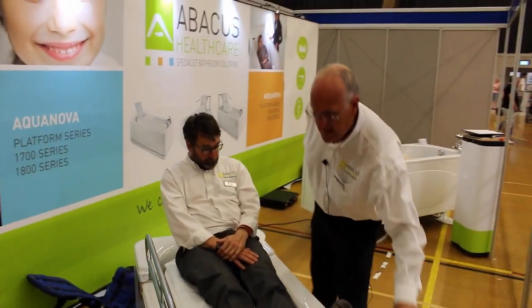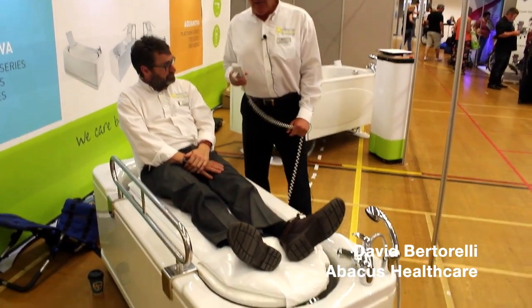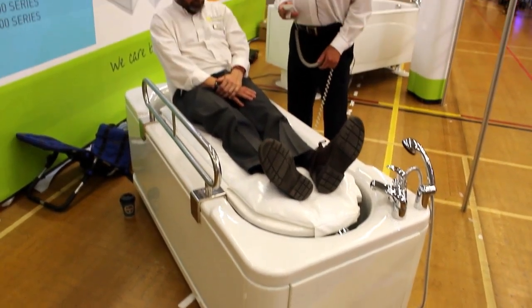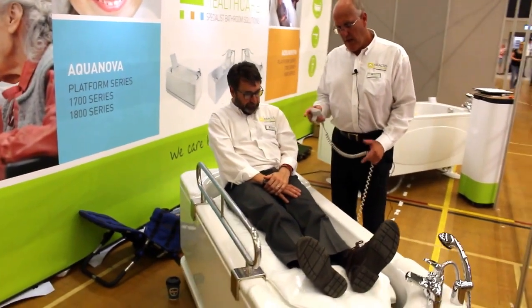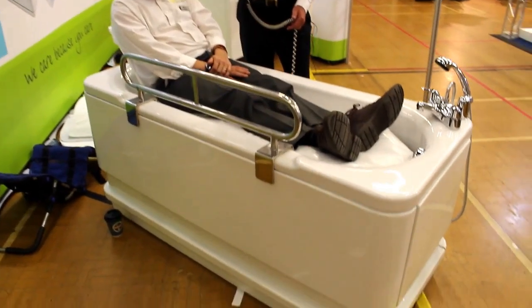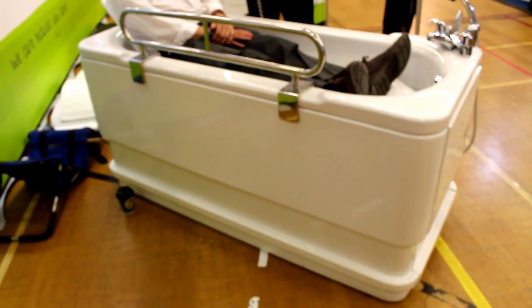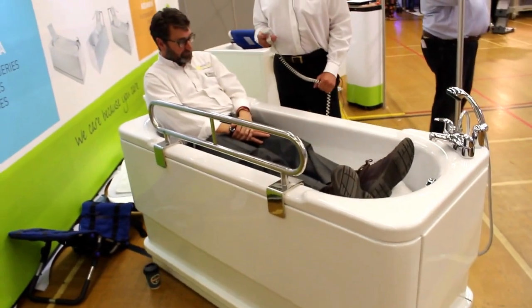What we have here is the Gemini height adjustable platform bath. My colleague Bob is sat on the platform ready to use the bath. What we're going to do is raise the side of the bath including the water level so that eventually he will be submerged in the water. It takes about 20 seconds to get to full depth, and when you get to full depth the water level should be between Bob's sternum and his belly button, so most of his lower body will actually be under the water.